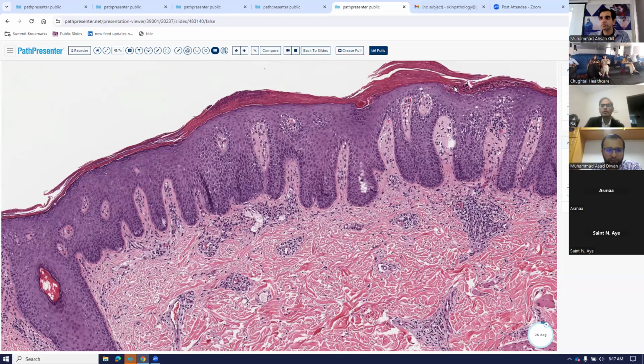And one more important thing is whenever you see neutrophils, you always have to do the PAS stain to make sure this is not fungus, because about 1 in 100 cases could be related to fungus. And that one patient, you're going to save them from lifelong treatment of psoriasis. Psoriasis is a lifelong disease and they will be given treatment for life. For that one patient, if you don't do the PAS and you miss the fungal disease, they might be given treatment for which they don't need. And psoriasis treatment can be pretty expensive. So it's better to always do the PAS, even for that 1 in 100 case that is going to be positive for a fungal disease.